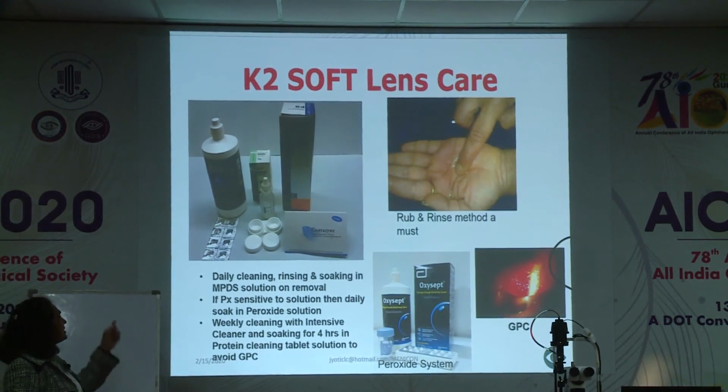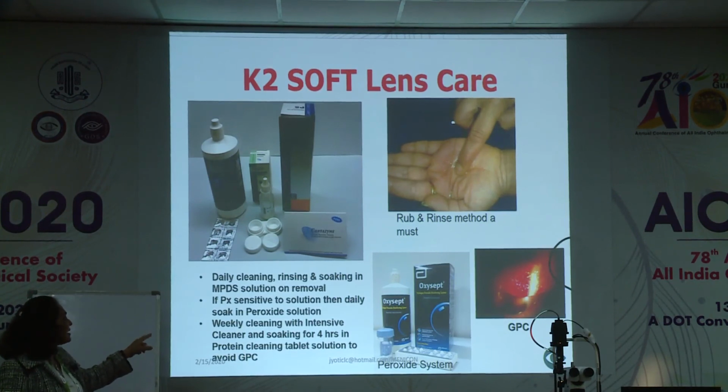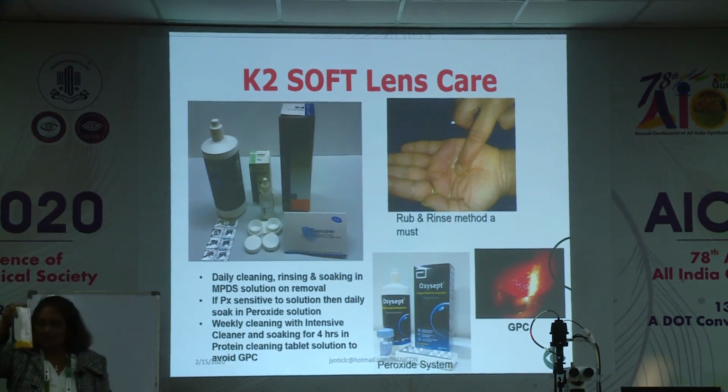And the most important thing is soft lens care. In India, you don't have a peroxide system, so it's very important that if your patients have got allergy issues, then to make sure that the lenses are soaked in saline solution before you actually make the patient wear the lenses.